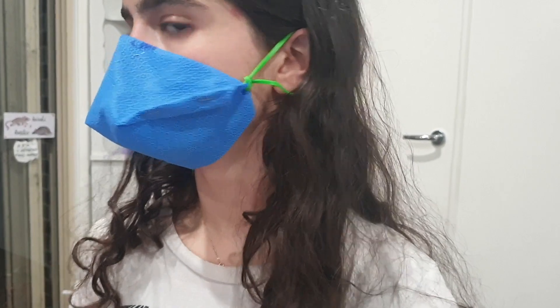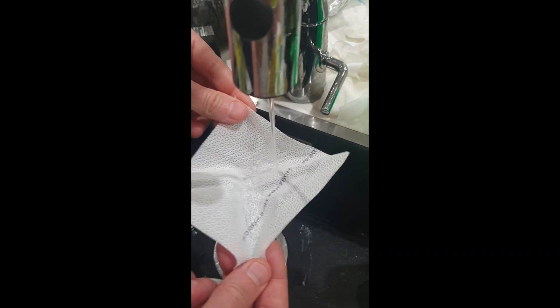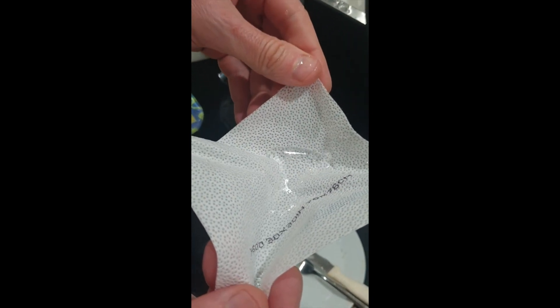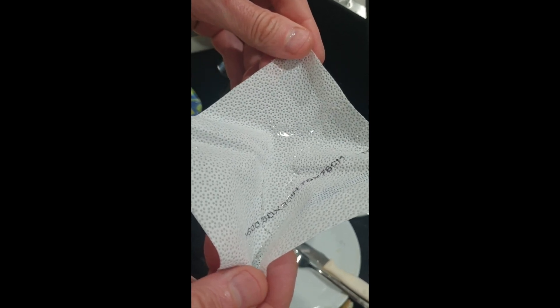Depending on the level of filtration needed, the mask can be made out of one or two layers of surgical wrapping. As you can see, the waterproof nature of this material also means that it can be disinfected or washed and then reused. If you have or are making fabric masks with filter pockets, this material can also be used to put in those pockets in order to create an effective barrier.